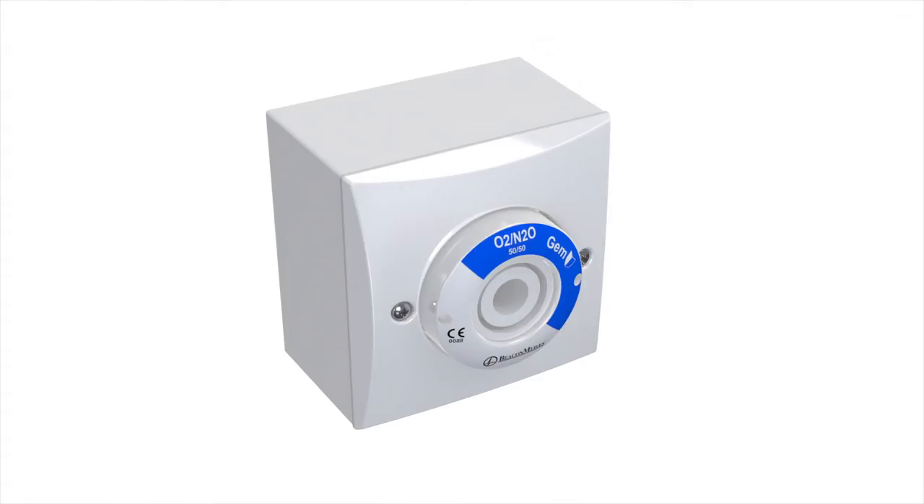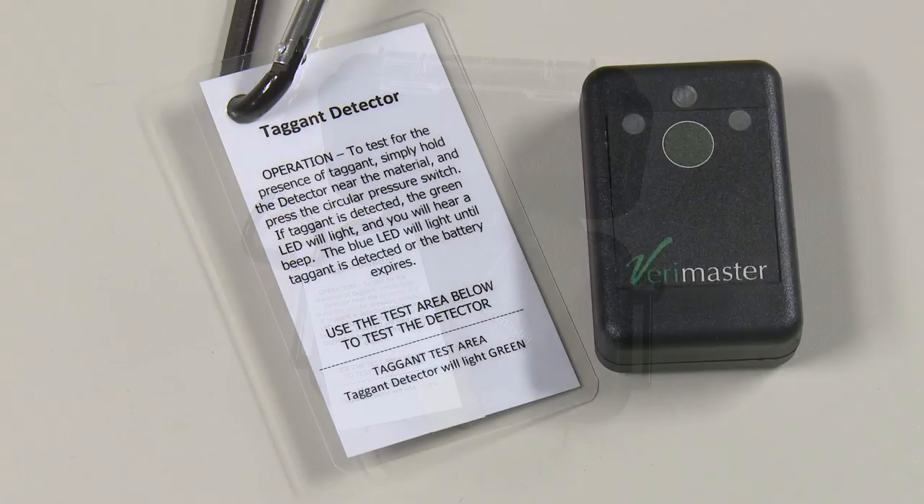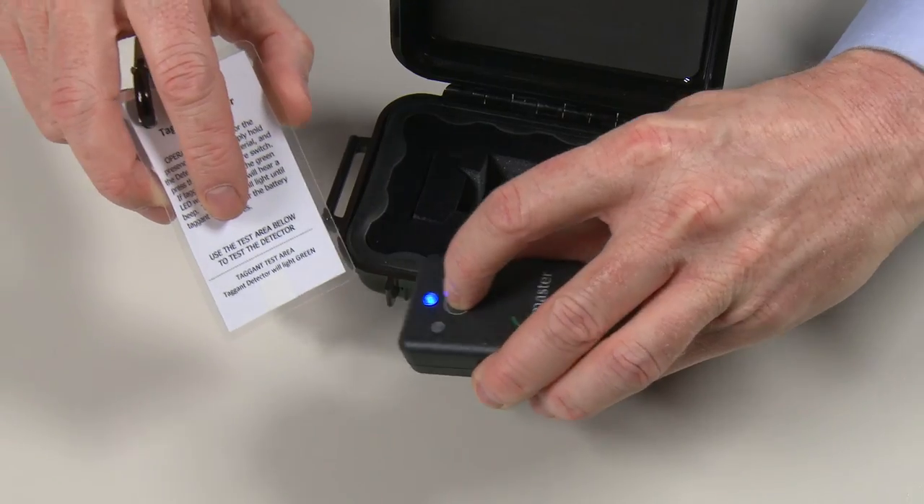The antimicrobial additive is included in all user accessible parts including the ink. The additive is mixed with the plastic during the moulding process, providing inherent protection which lasts the lifetime of the product. The antimicrobial properties can also be validated using a verification device.